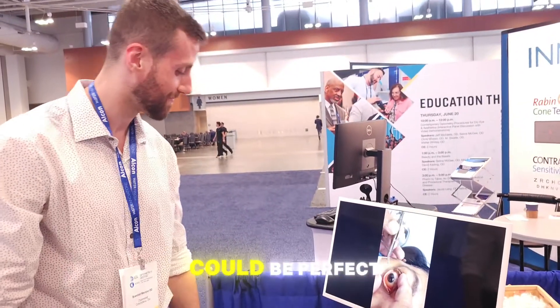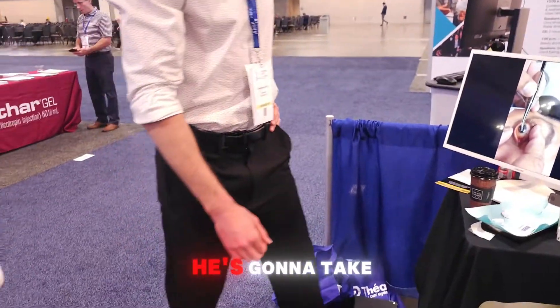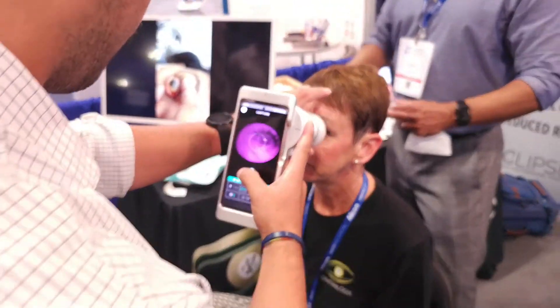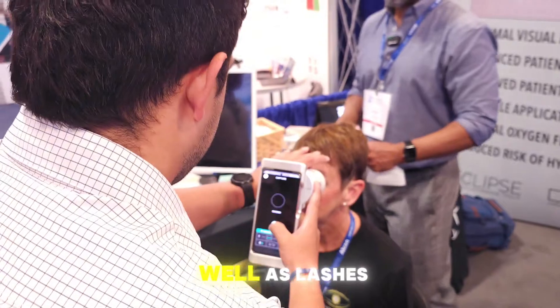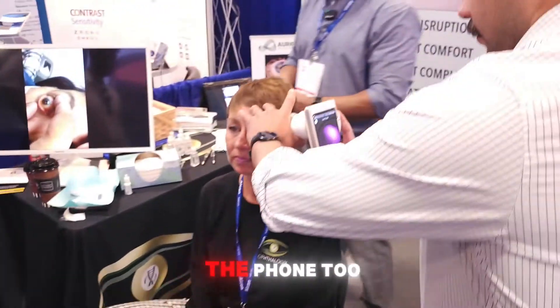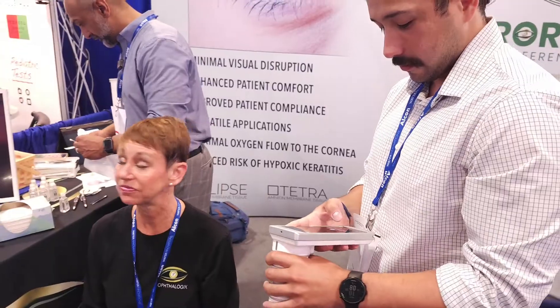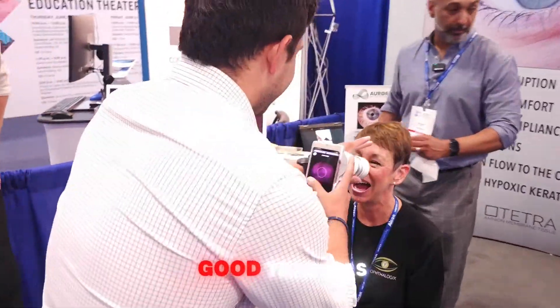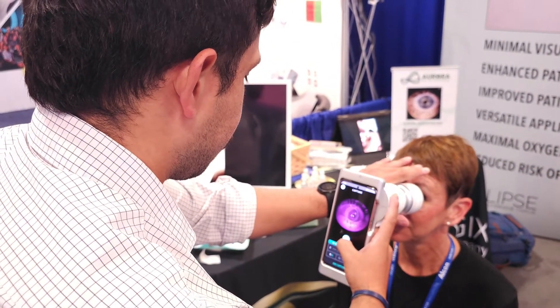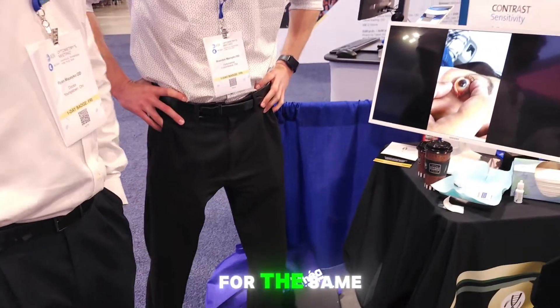You can see what it looks like up close — he's got a wonderful imaging device, with anterior and posterior segment images as well as lashes. For a first time, that was really good. If we were billing, that would have been billed 12 times yesterday for the same eye.